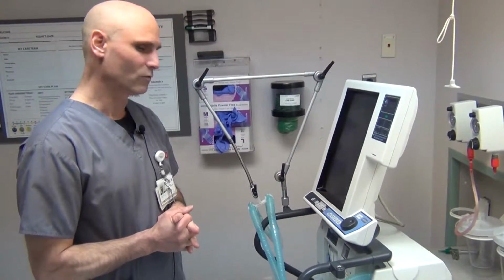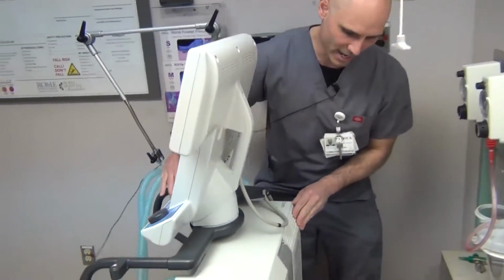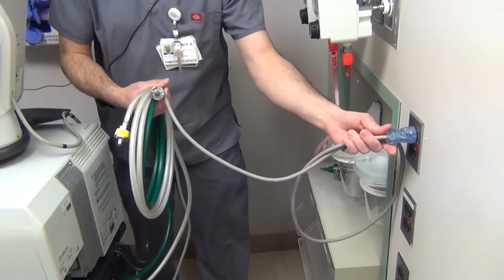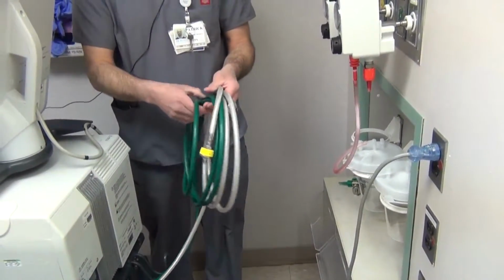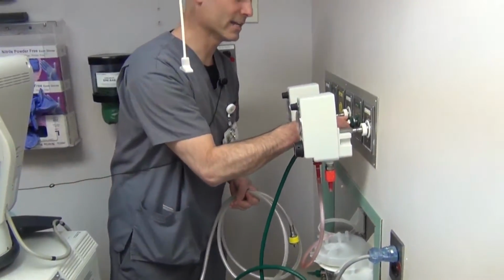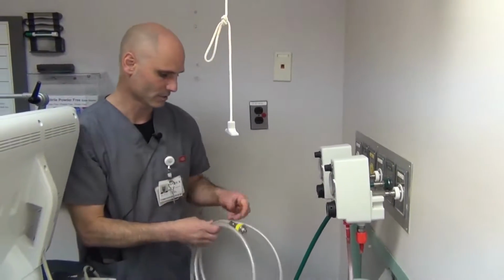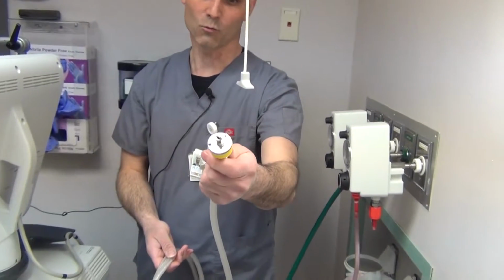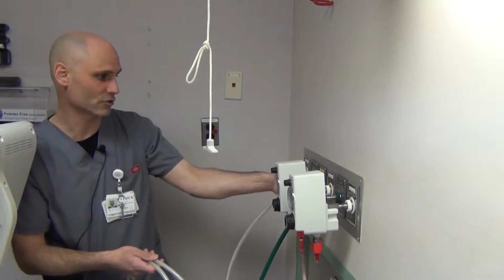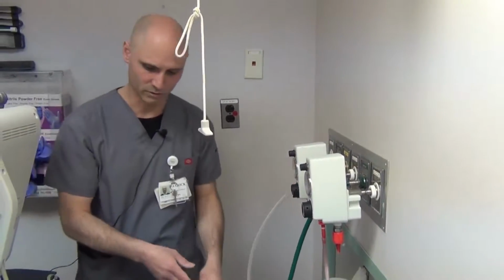So at this point, we'll look at the back of the machine, and we're going to look at some power cords that are in the back. You have three. You're going to have your power cord, which you'll plug in. You'll have your oxygen tubing, which you'll plug in also into the wall. And there's two prongs, and you just line it up and push in until it clips. The air one has two prongs that are different shapes, so you cannot make a mistake, and you got to make sure that it's well fastened in the wall, that you can't pull it out like I'm showing you. So there you go, it's plugged in.